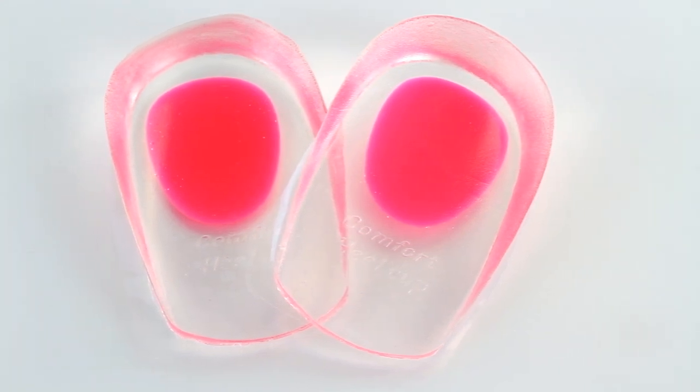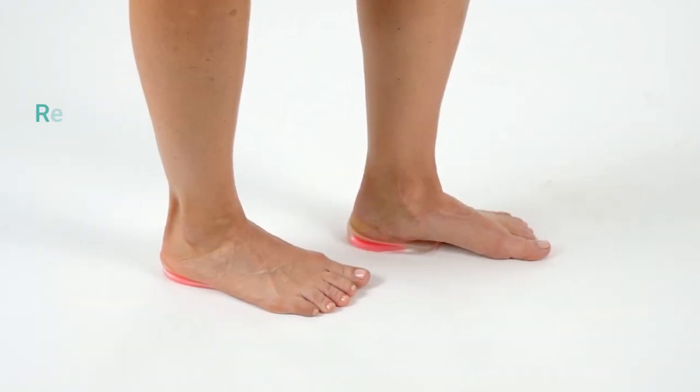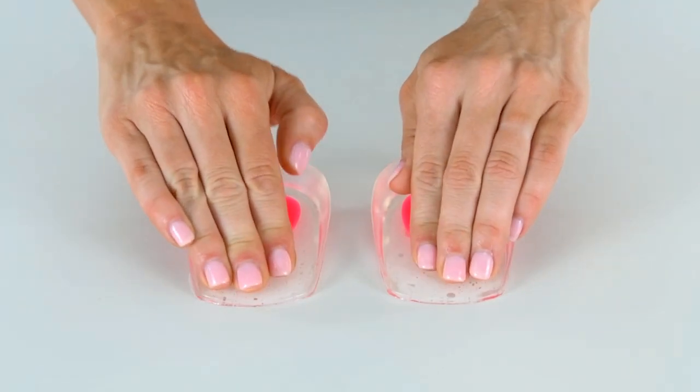The Heel Cups by Vive Sol provide all-day cushion and support for your heel and ankle. Durable gel relieves pain and discomfort caused by swelling, spurs, and plantar fasciitis while evenly distributing the pressure of each step.